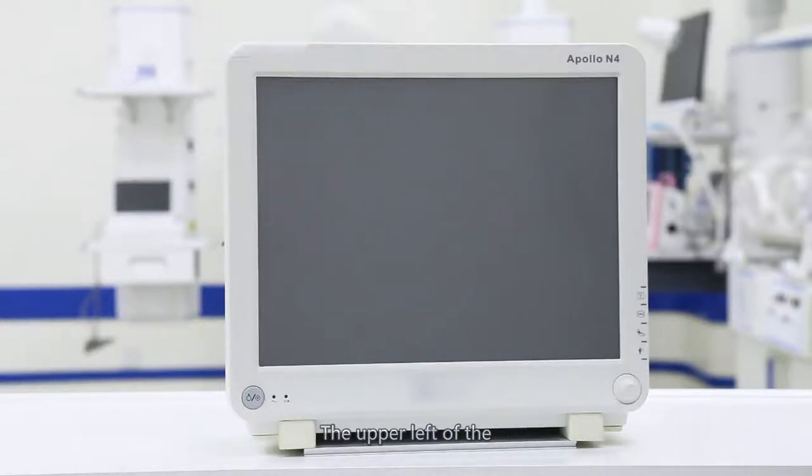The upper left of the machine is an alarm light. According to different alarm levels, there are high, middle, and low alarm types.